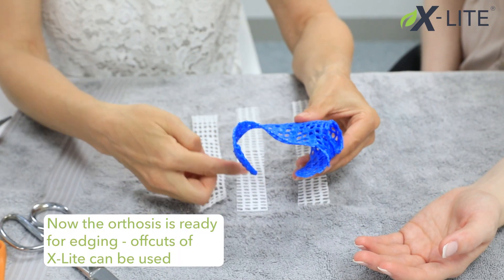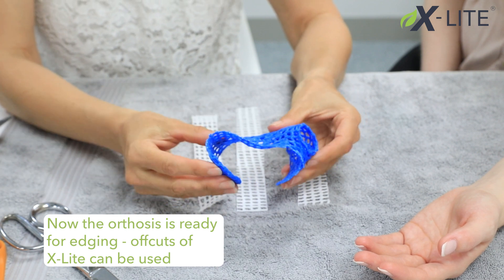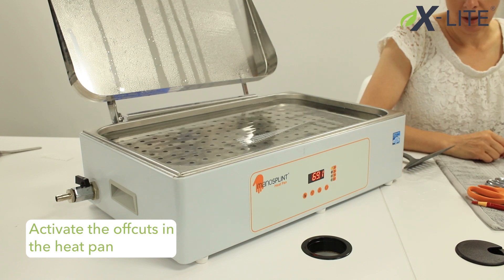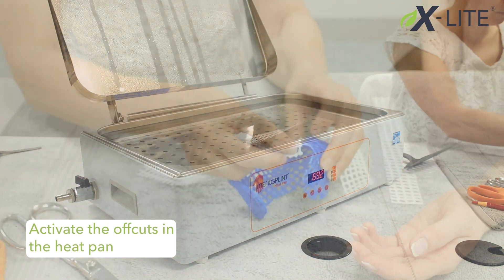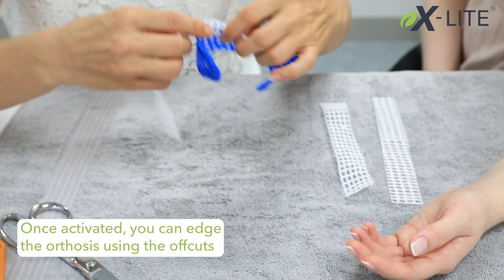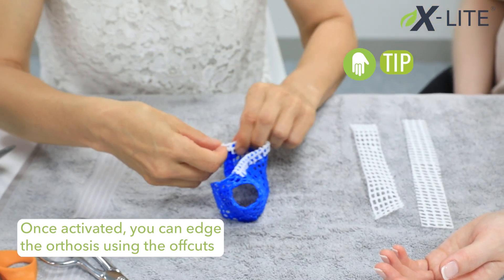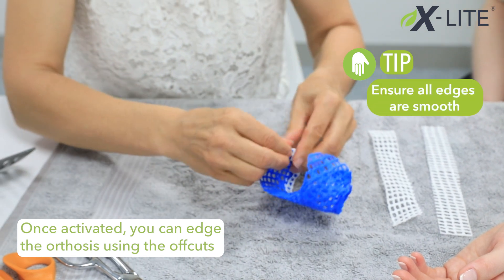Now the orthosis is ready for edging. Offcuts of X-Lite can be used — activate the offcuts in the heat pan. Once activated, you can edge the orthosis using the offcuts. Ensure all of the edges are smooth.